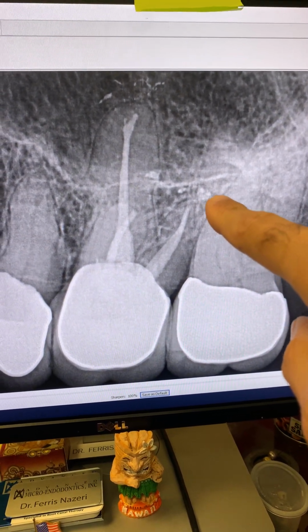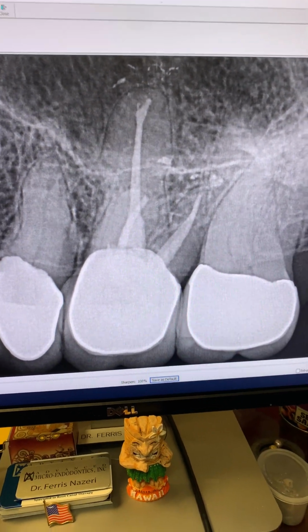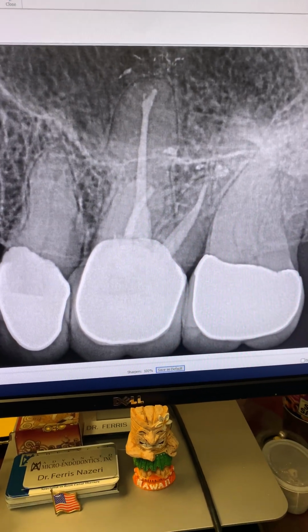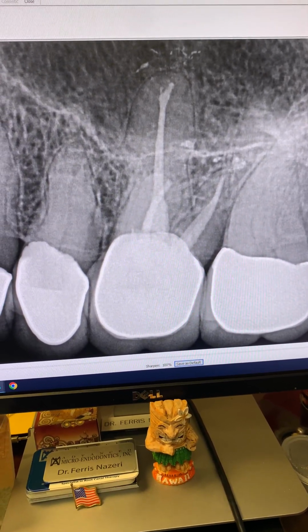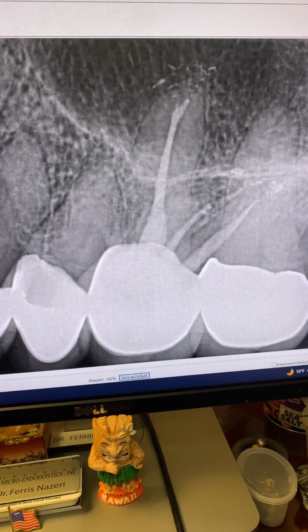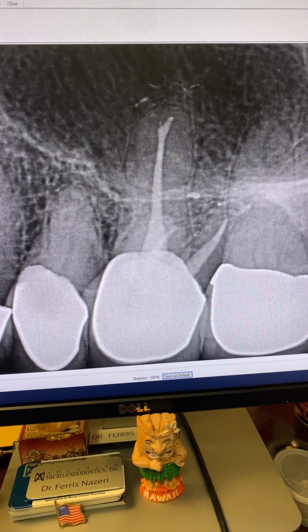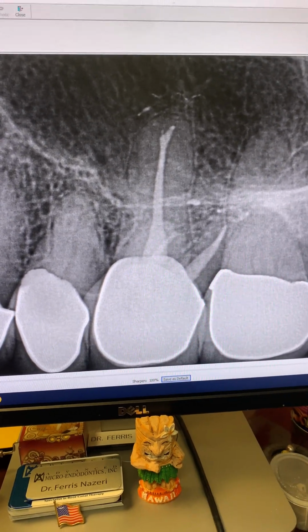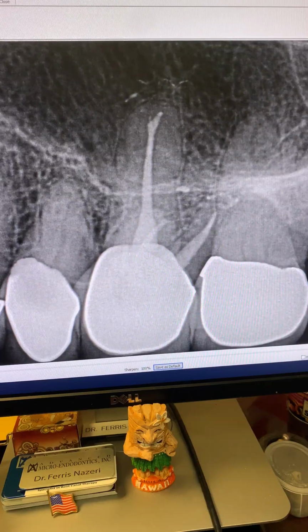There's sealer extrusion there, sealer extrusion there. It didn't have any negative effect on the outcome of endodontic retreatment, as you can see here. All right. 11 years post-op of tooth number 14 that I had worked on, this 94-year-old patient. Now, at the time, she was 83. 11 years post-op. As you can see, the tooth is in full function. She has no symptoms. She couldn't even remember that she was here 11 years ago for me to redo the root canal. 11 years post-op of tooth number 14.